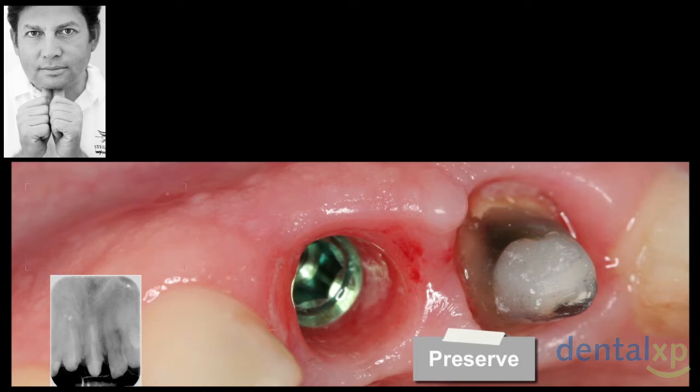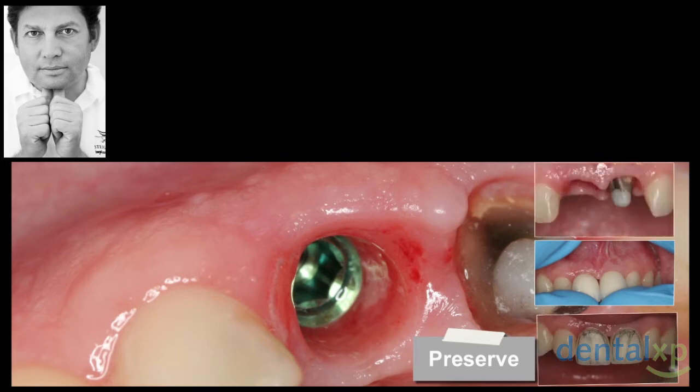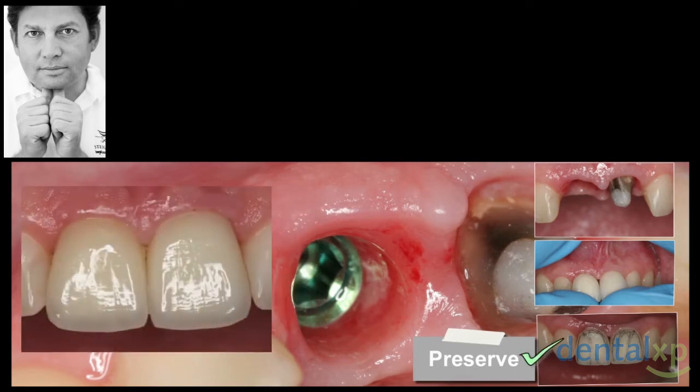It becomes difficult when we go to the next step and we have to go for delayed implant placement or early implant placement. In this case, for example, we place the implant, we can maintain the interproximal soft tissue, and then with the prosthetics, we can use temporary crowns. But if we don't have any deficiency, we can maintain this tissue, and this is a very predictable way and very much published in the literature. The crowns, the pressure of the interproximal space, that's something which we learned, and we can achieve good results. Now we will go back and see what's the long-term follow-up of these cases when we develop soft tissue.